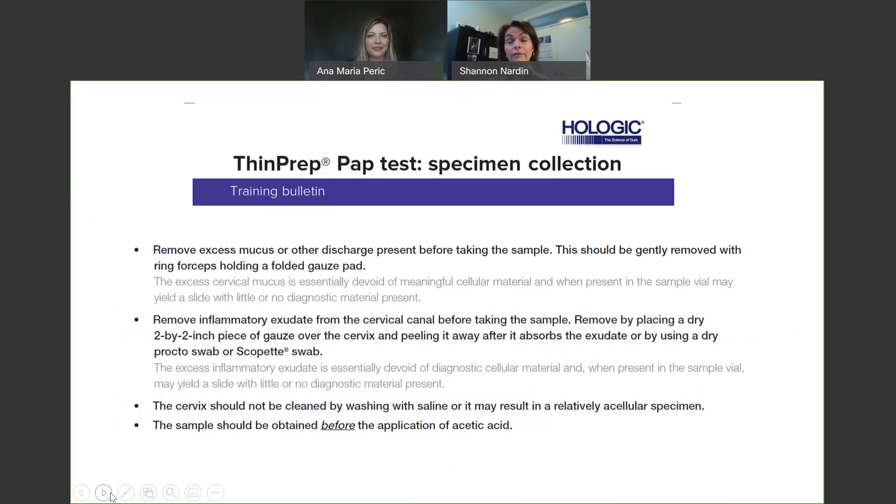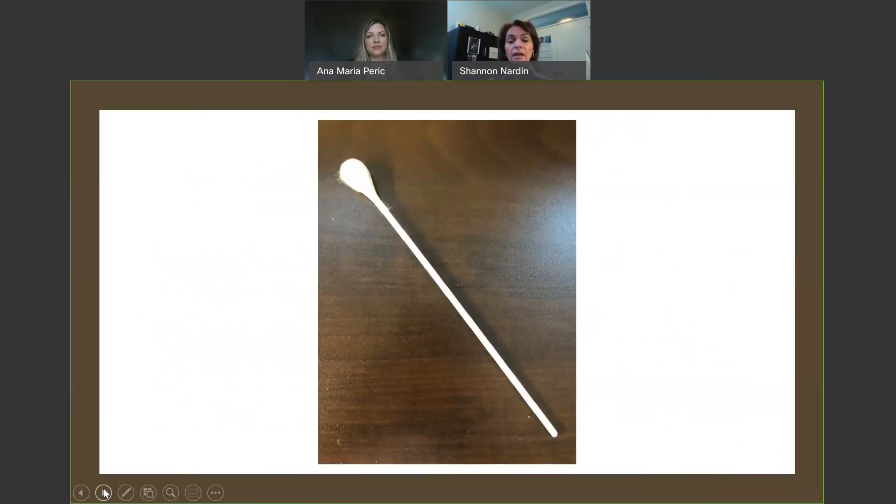Now that we've covered what the patient needs to do, let's give a refresher on what we need to do in order to get an adequate sample. We need to prepare the cervix. This is not a ThinPrep-specific technique — this is just general pap collection technique where we want to remove that excess discharge and mucin from the face of the cervix. If we do not do that and we go to collect the ectocervix sample, that's all we're going to collect, and that's typically acellular, which will give your patient an unsatisfactory result. We would like to have the cervix face cleared by putting a two-by-two gauze on the face of the cervix and then removing it with ring forceps to pull off that excess mucin or discharge. The other option is to utilize a swab, touching the face of the cervix and doing a 360-degree rotation to move the excess mucous plug and any discharge.